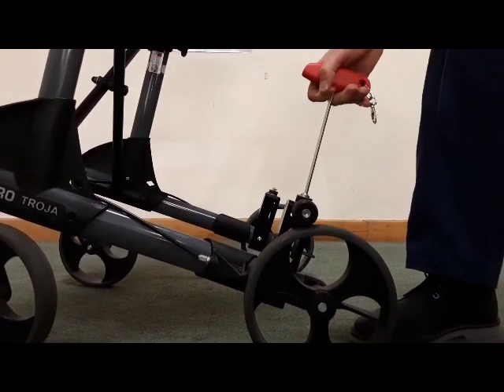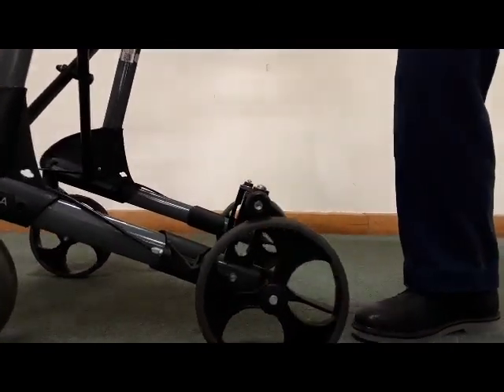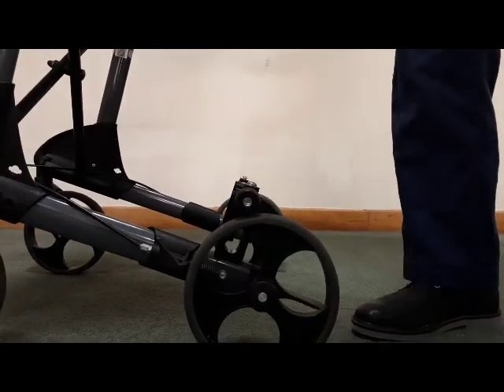Each turn is represented by 180 degrees. You want to match the same width as the position, and you can pull the hook out from the front.